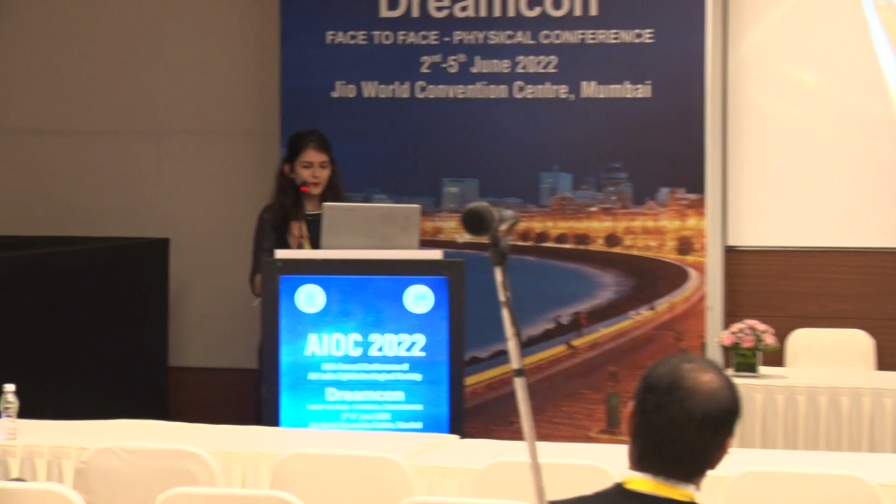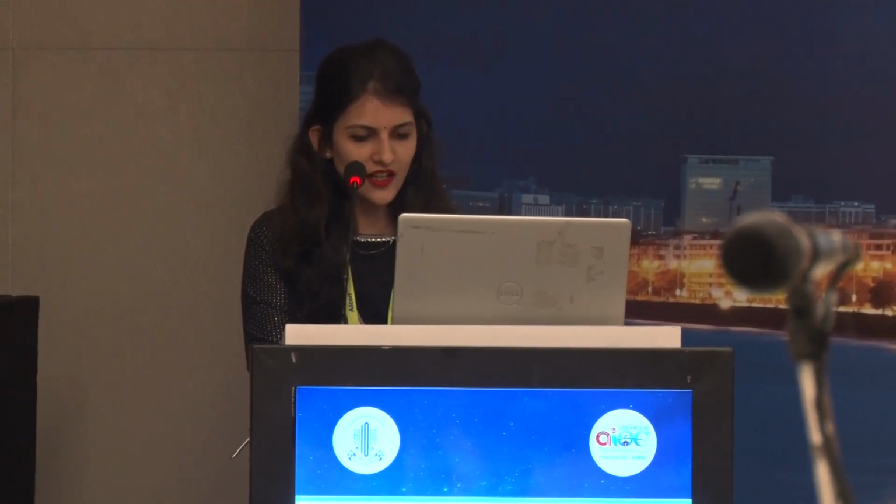Good morning, everyone. So let us talk about optical calculation blunders in IOL power calculations. We have different optical media starting from the tear film, the cornea, the lens, the vitreous, and the retina. Each of these media can induce some amount of aberrations and can result in some amount of prediction errors with respect to your IOL power calculations. So we'll go one by one and discuss one case scenario for each of these.